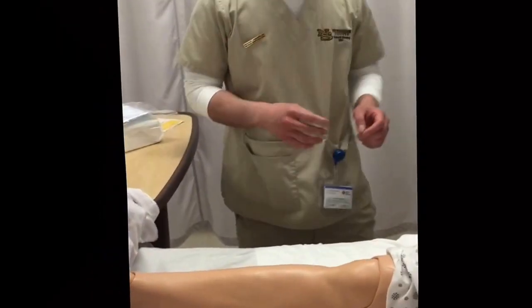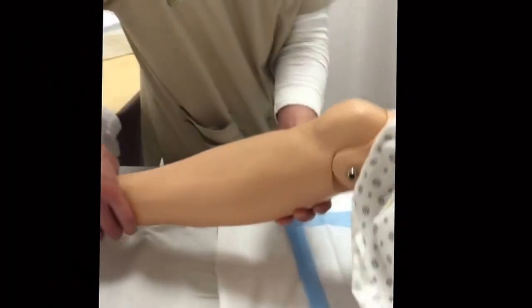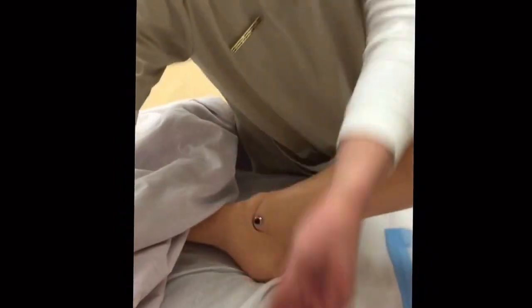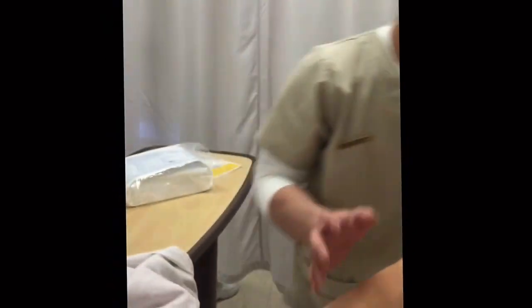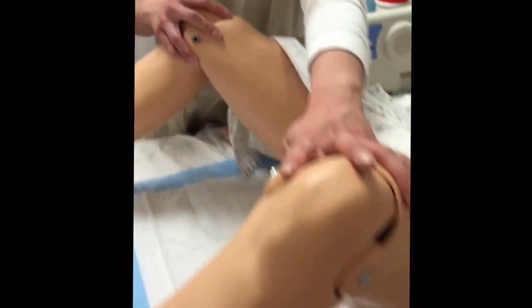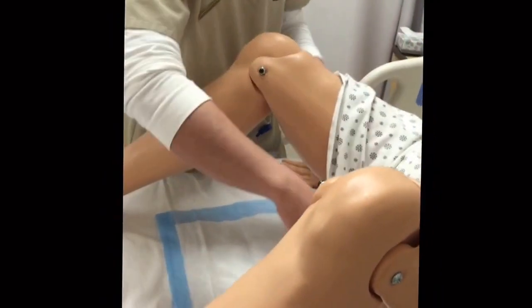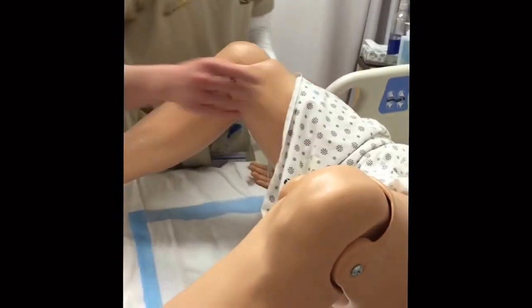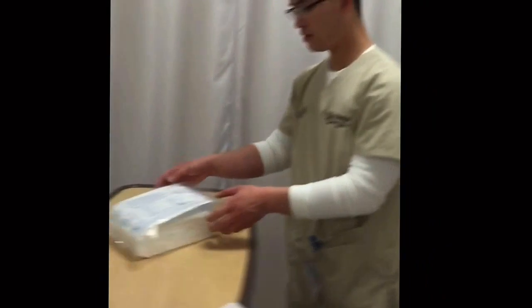So please, if you can just flex your legs up for me, please. Make sure it's 2 feet apart. So just like this. This is what we call the dorsal recumbent position. Make sure the patient's legs are flexed and the legs are apart like this. And provide privacy while you're preparing your kit. Alright, that's good enough, Miss Susan. So let me just go ahead and prepare my stuff.